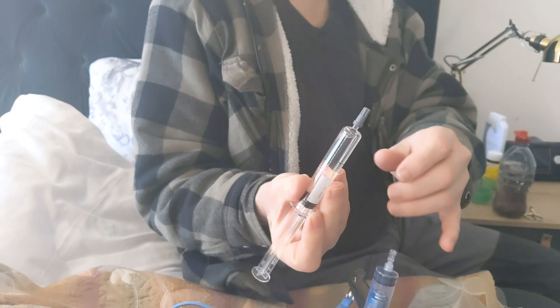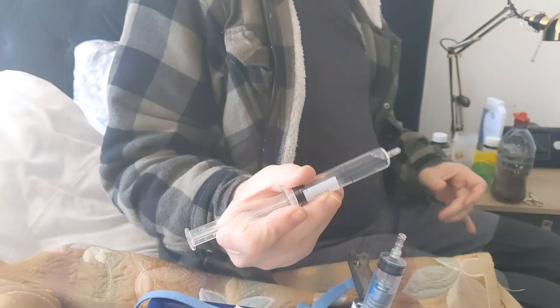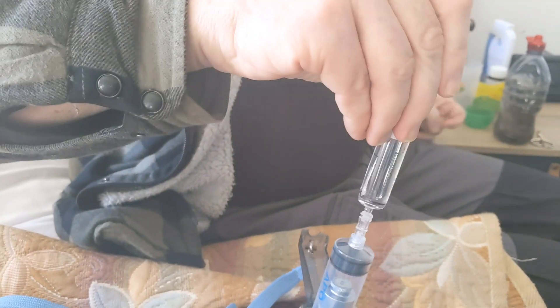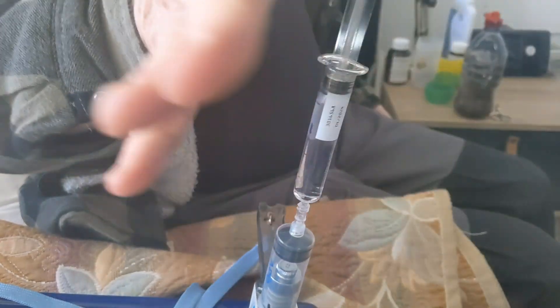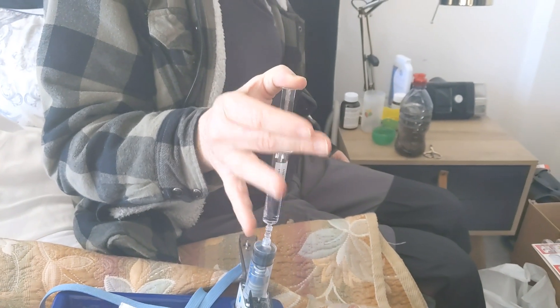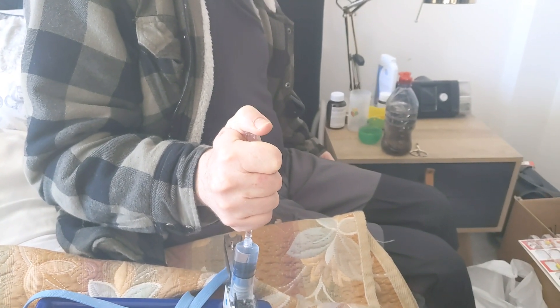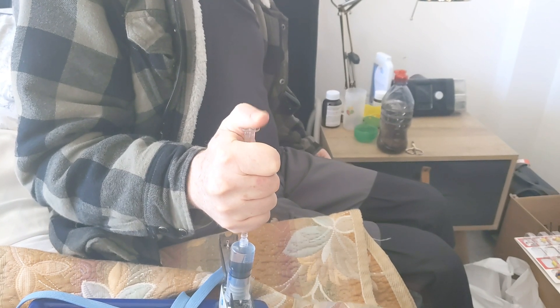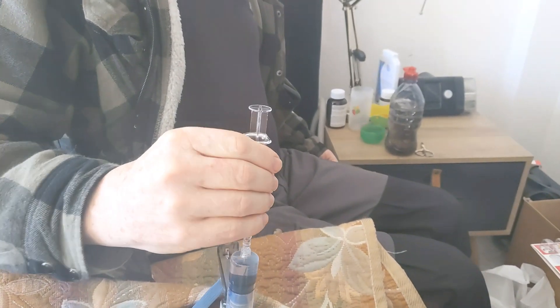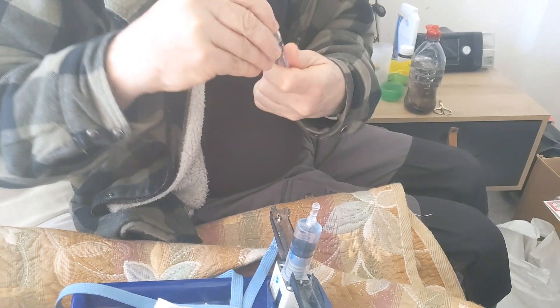I now take this syringe containing the apomorphine, pull the rubber cap off, and put this into the connector. My thumb is on the very top part and I press downwards, then squeeze as much as possible. I'm holding the main part of the body and squeezing it down as far as it will go. Then I turn the syringe, take the rubber cap I removed previously, and throw it into the bin.